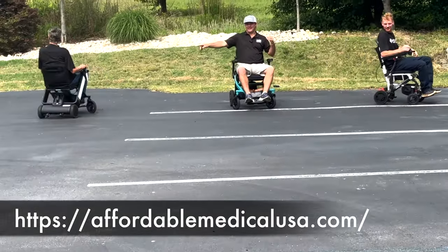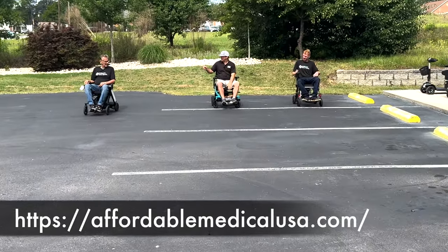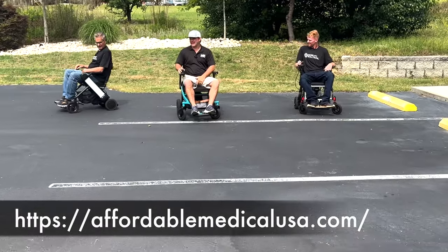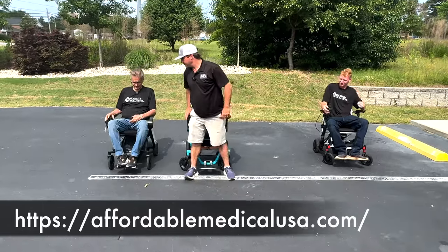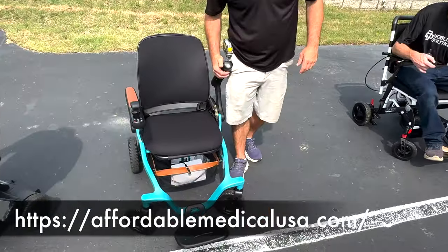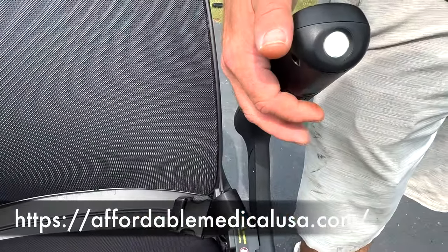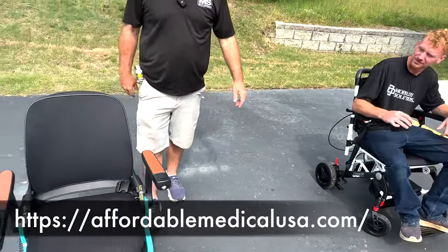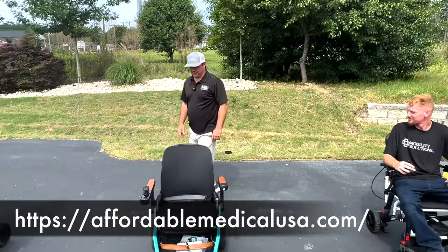Well, the F5 is a little bit better acceleration. What mode? We need to find out what mode that's in, though. That's got three different modes. They might be in sport mode, but we'll have to look. Oh, another cool thing about the Ally that we like, it has a light with a soft touch and a light at the back that's always on. No light. I like it. People might not think it's a big deal, but I think it's a big deal.